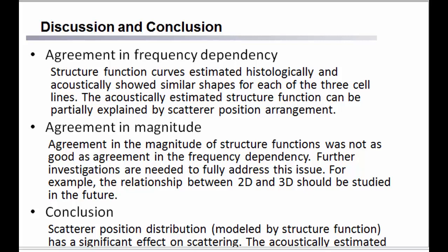So to conclude, we found good agreement in frequency dependence for the structure function curve estimated from histology and from ultrasound. The agreement in magnitude is not as good. This is probably because we use the 2D slice instead of 3D slice.